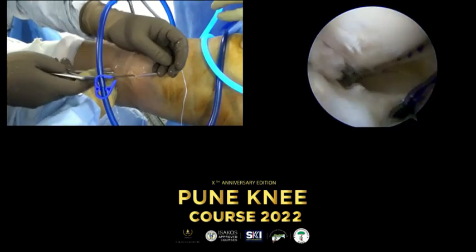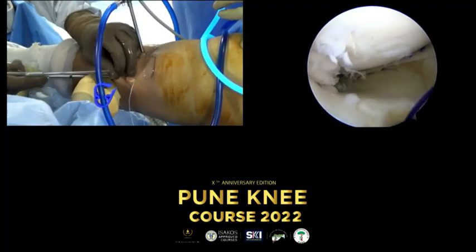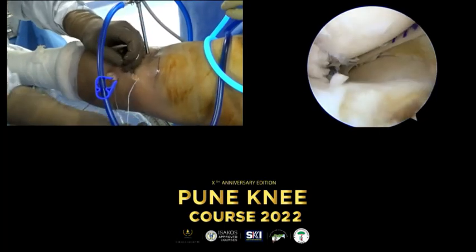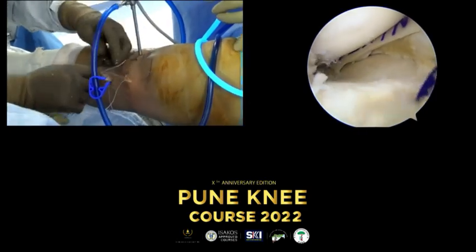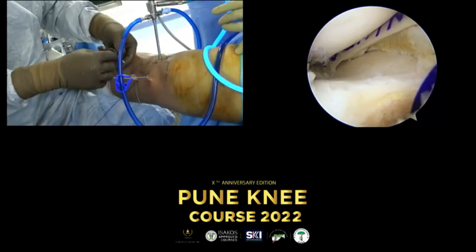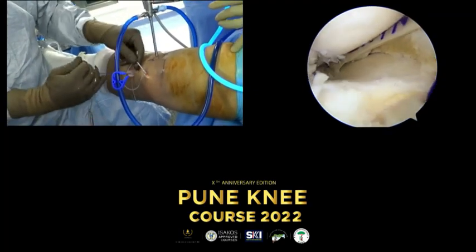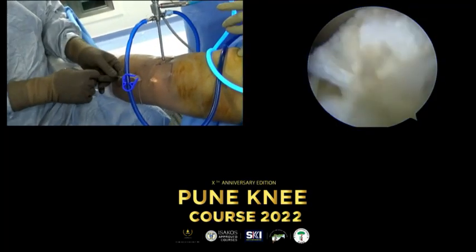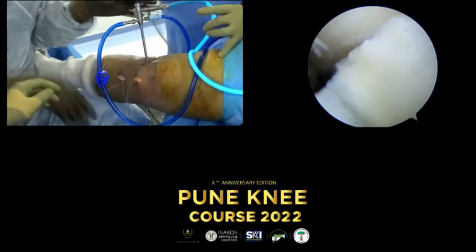It's possible. I mean, you can use knotless fixation. If you're going into the tunnel, wouldn't happen. I think it's all about access. If you can get that line of attack, you can do that. But traditionally, I think what we've looked at is that pullout sutures have the best strength, and for a root repair, I would always prefer now a pullout suture rather than use a suture anchor in the back.